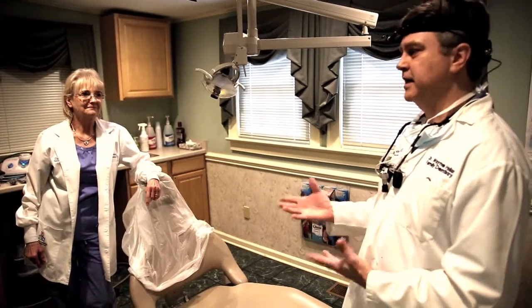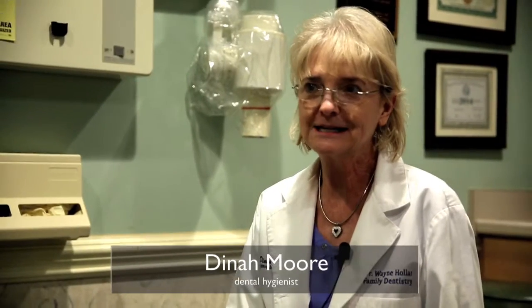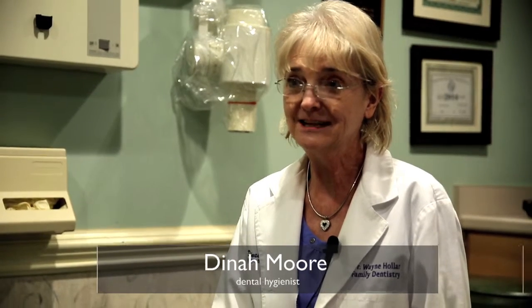Hygiene also, when I do hygiene checks with pediatric patients, come into the room, pediatric patients are sometimes hesitant. They don't know what to expect. And we use the camera when we're doing the exam to show the kids their mouth. I tell them, have you ever been on TV? And they said, oh, no. And I said, well, you're going to be on TV today. Then when Dr. Hollar comes in, I tell him, we're going to go now to tooth TV. And then we switch over, and it's their mouth that they're seeing.